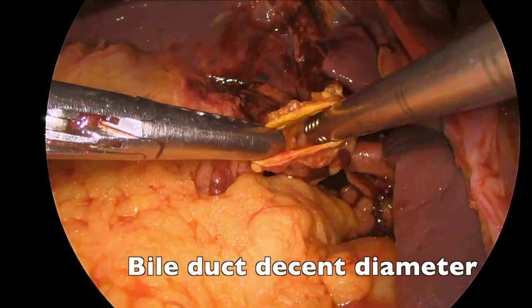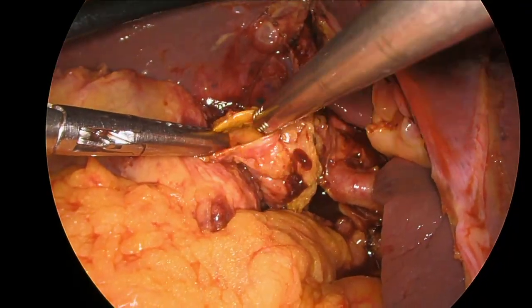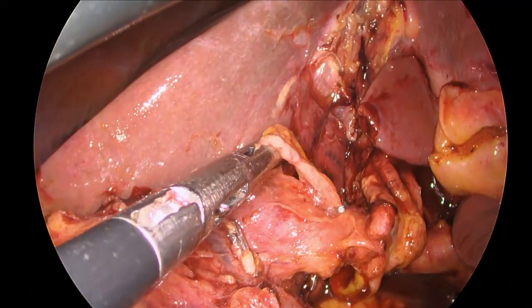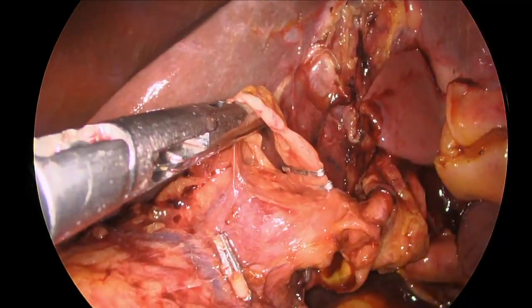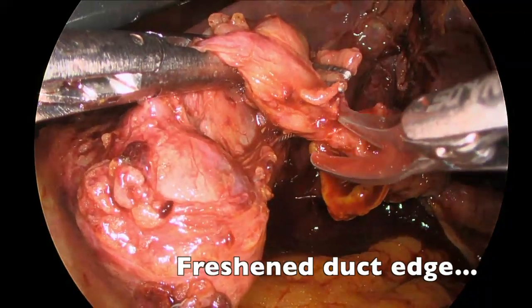In terms of a laparoscopic repair, we have a nice wide bile duct to anastomose to. In order to facilitate repair, the gallbladder is removed first by identifying the cystic artery, clipping and dividing it, and then we freshen up the transected edge of the bile duct.